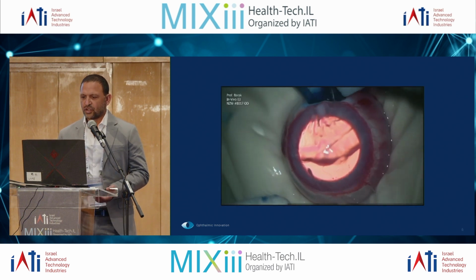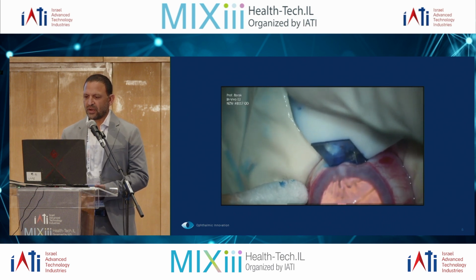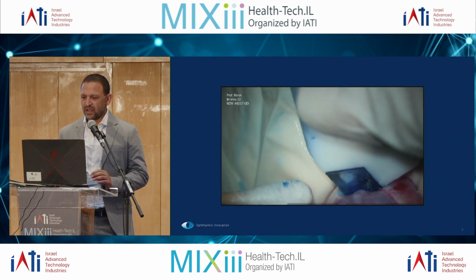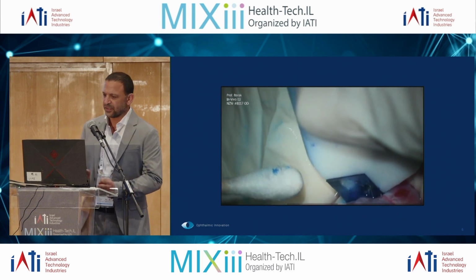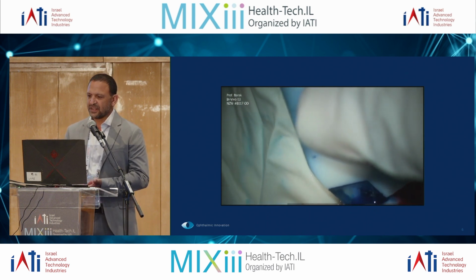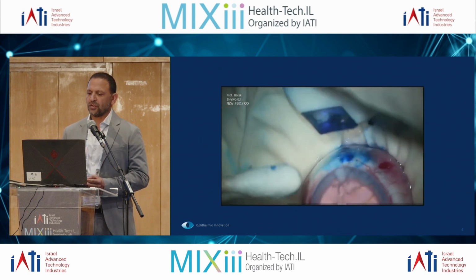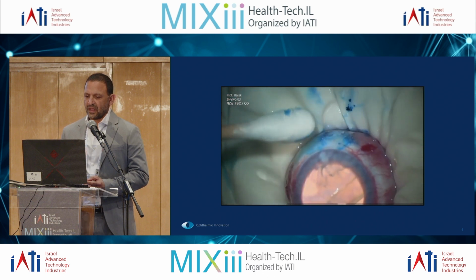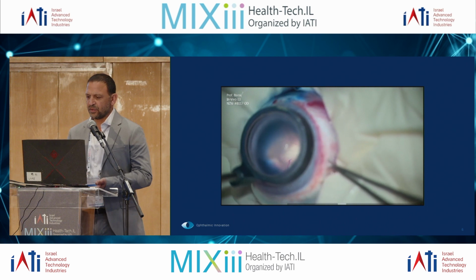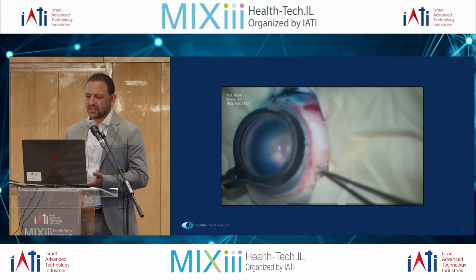This is an injection of trypan blue in a New Zealand white rabbit. Professor Barak is locating the injector on the limbus. The transparent segment of the device gives the confidence that the injection is at the correct location. And you can see the needle penetrating through the conjunctiva and the sclera with minimum pressure on the eye. Now he used a gonio lens to demonstrate that the pigment spread to the back of the eye immediately, just like in the animation.